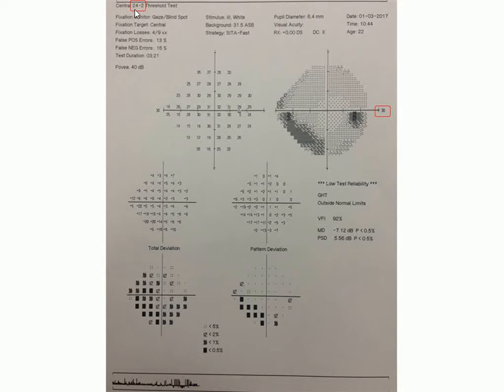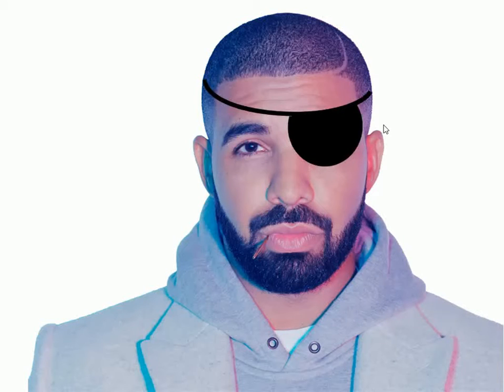I want to address first the size of a patient's visual field and how it relates to the testing that we're doing. In our example here, we see these numbers, 24 over here and 30 over here, and I'd like to explain what that means. We first need to consider again what the size of a normal person's visual field is. So we have this celebrity volunteering for our study, and we'll consider that he is patched on one eye and looking straight ahead, and we'll see where the ball needs to be in order for him to detect it.